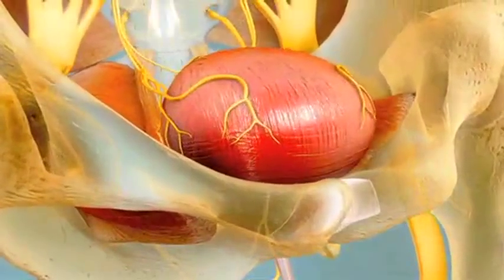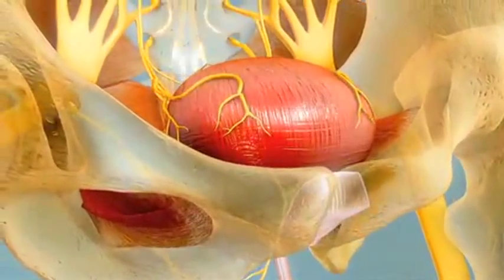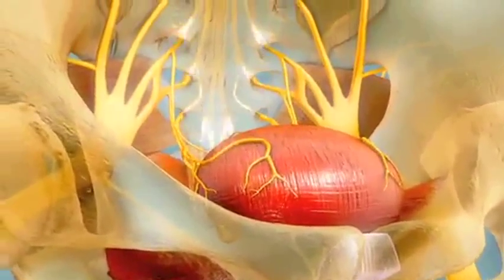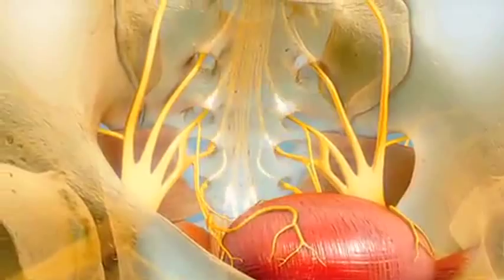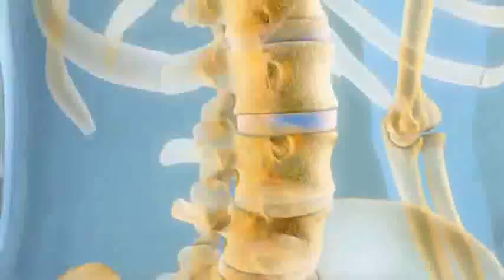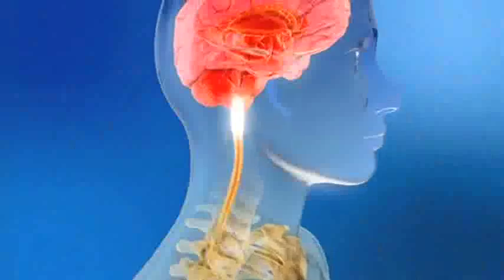During bladder filling, sensory or afferent signals convey information on bladder fullness, in part via the sacral nerves. The signal travels up the spinal cord to the brain.